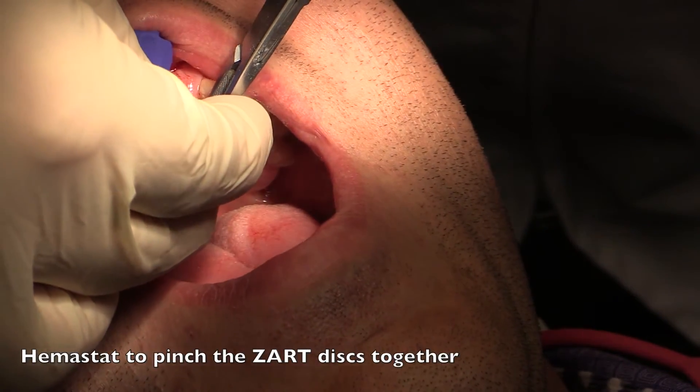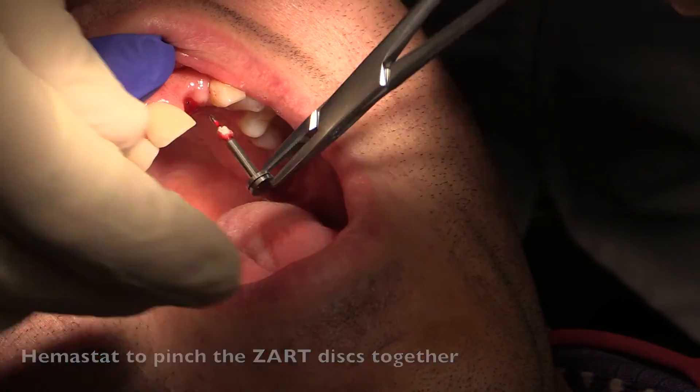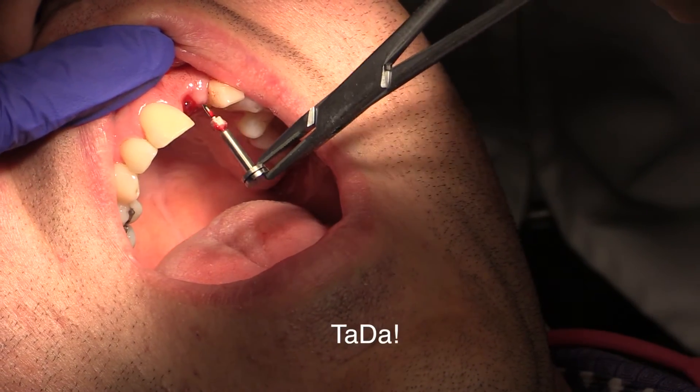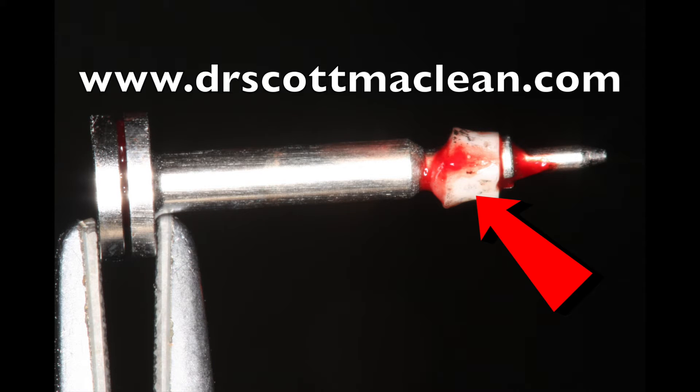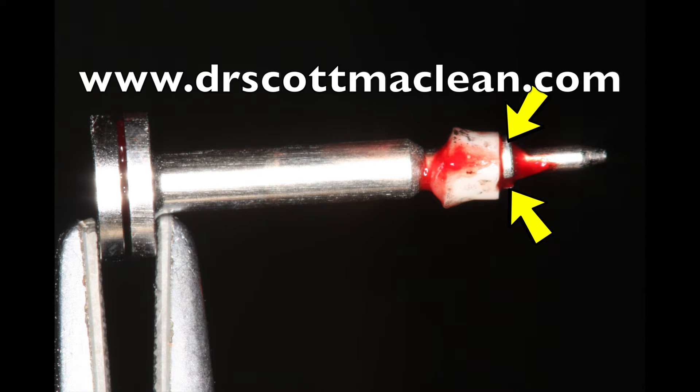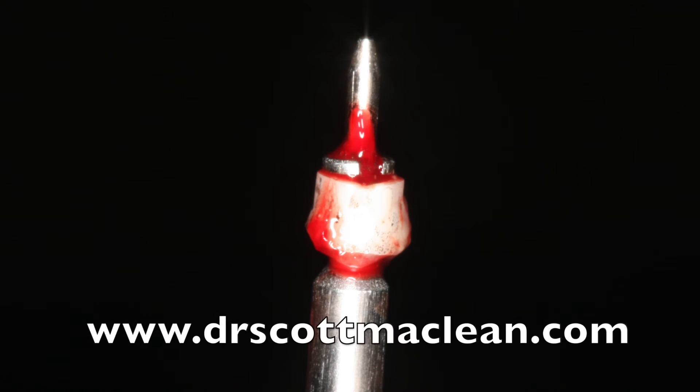Watch this — it's just amazing. You do one little pinch and then the piece of abutment comes right out, no problem whatsoever. The red shows the conical connection and how it was locked down in. We can see those two wings in yellow locking underneath the abutment as the pin goes through. As you push the hemostat, it pushes at the base of the implant and lifts the whole piece of zirconia up.